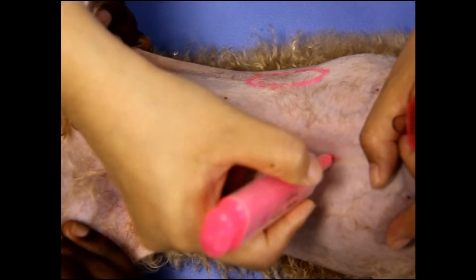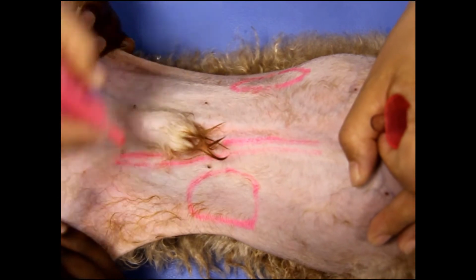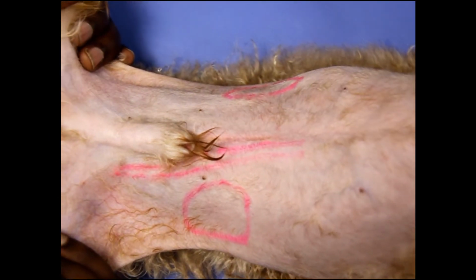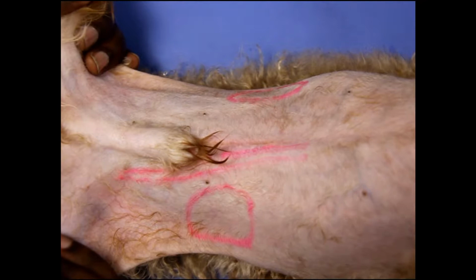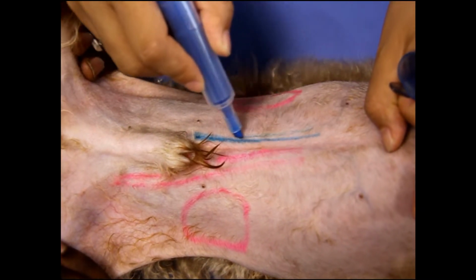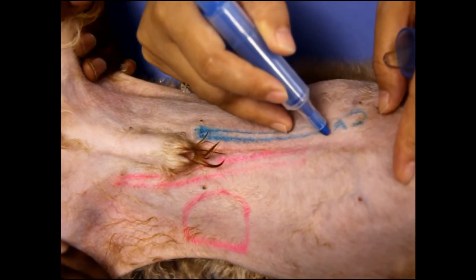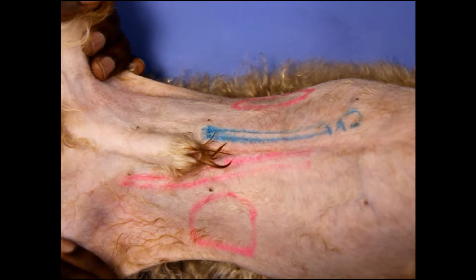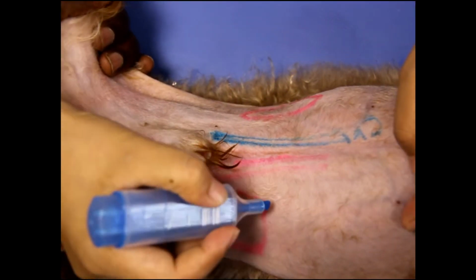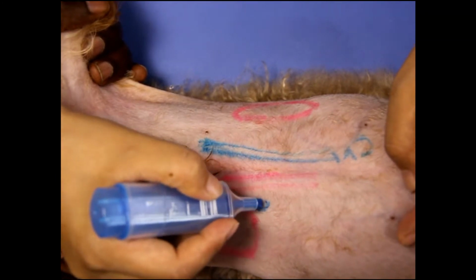And here is the aorta. And here is the caudal vena cava. And the adrenal glands: the left adrenal gland is somewhere here, like this.